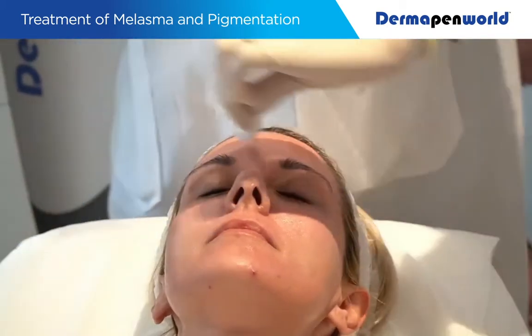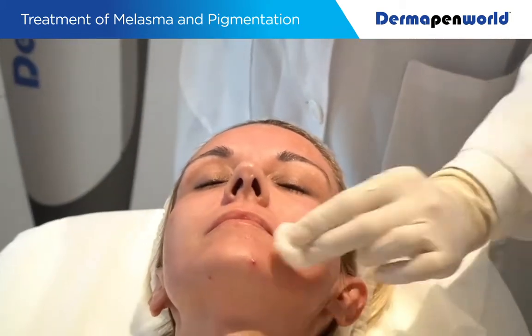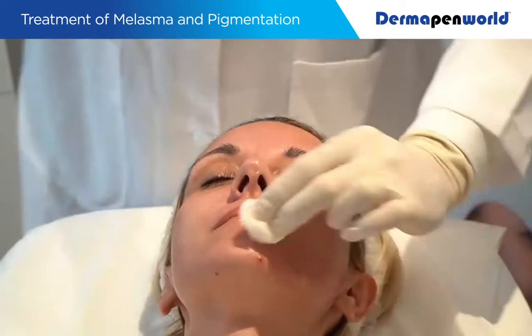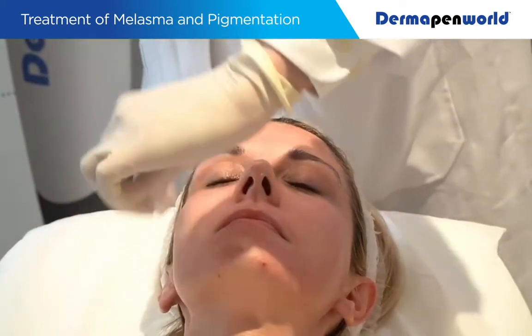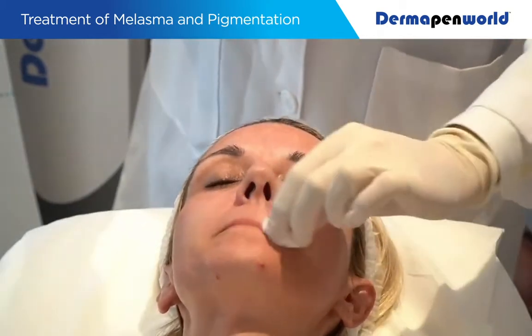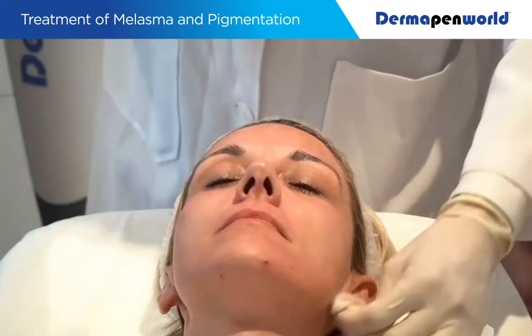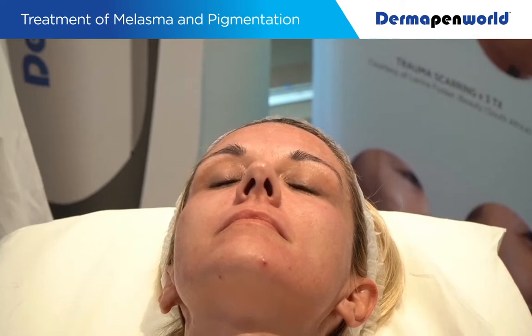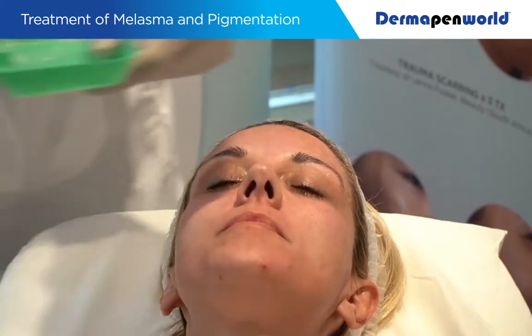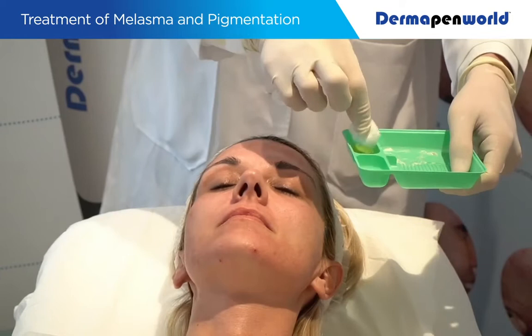So next the peel is going to go on. The peel is 25% mandelic acid, 5% lactic acid, 5% arbutin, 5% hyaluronic acid, copper peptides, pyruvic, ferulic, resorcinol, and retinaldehyde. For the peel, bring the peel to you, not you to the peel. So it is near the patient's face so that you're not going over long distances and getting it into eyes, nose, mouth, or ears. So it's going to go on.